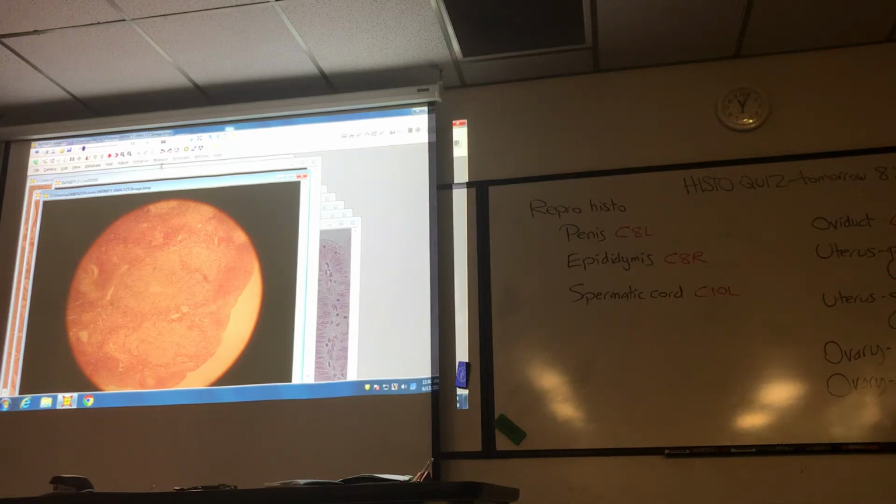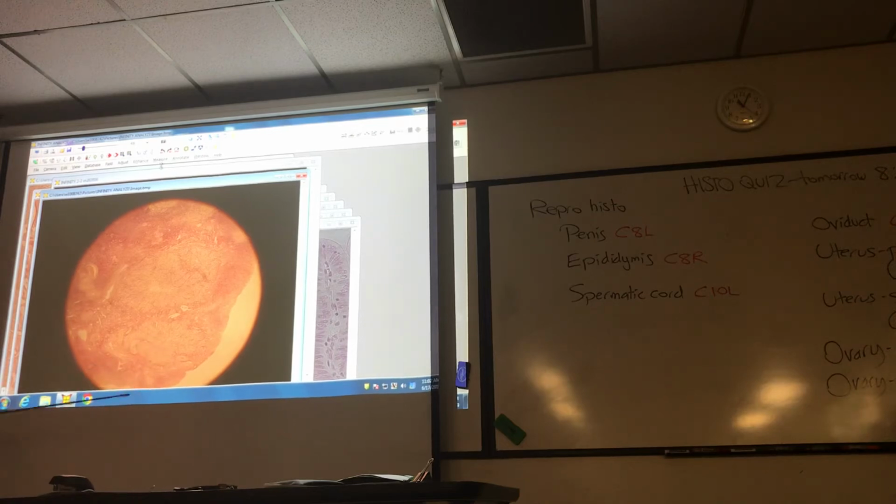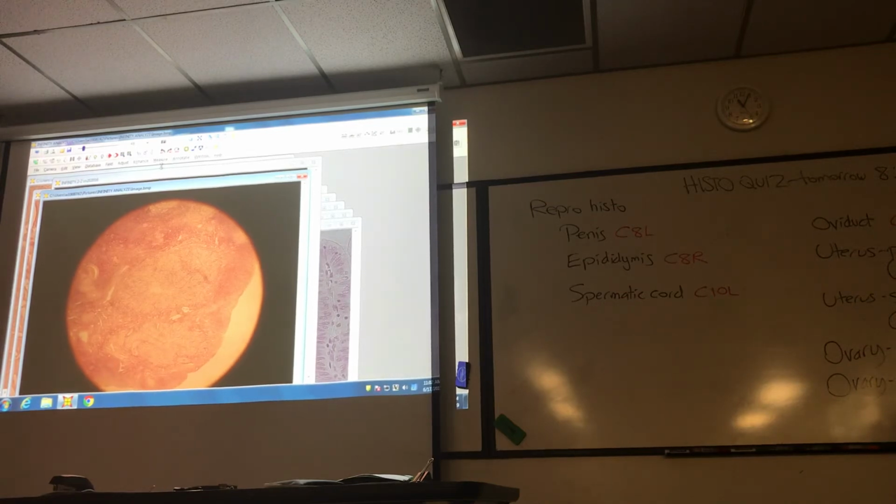Okay. This structure right here, do you see that? In there is the corpus luteum. It secretes progesterone and it causes the secretory phase the second couple of weeks of the cycle. Okay, so both are occurring at the same time. This is formed. It's an endocrine structure, secretes progesterone, causes secretory phase. Progesterone targets the endometrium of the uterus. And so identify that as corpus luteum. That's it. Done. And move on.